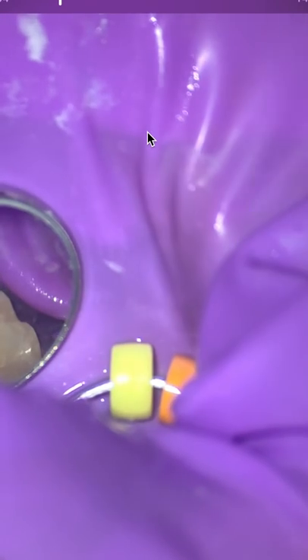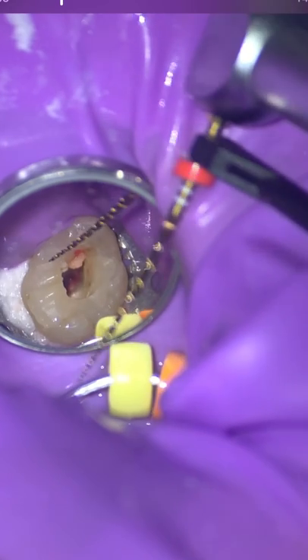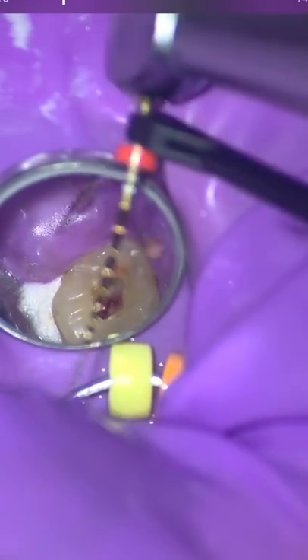I do the same in the palatal canal. I get to my working length with my Apex locator, and then we take my length, and that's it. But in the meantime, the apical millimeter of this file has gone too far. With a tooth that's already symptomatic, with symptomatic apical periodontitis, there's inflammation down there. Patients have pain on percussion, and sometimes those PDLs don't want to stop bleeding. That's why this technique I'm going to show you is actually effective, I think, in these cases.